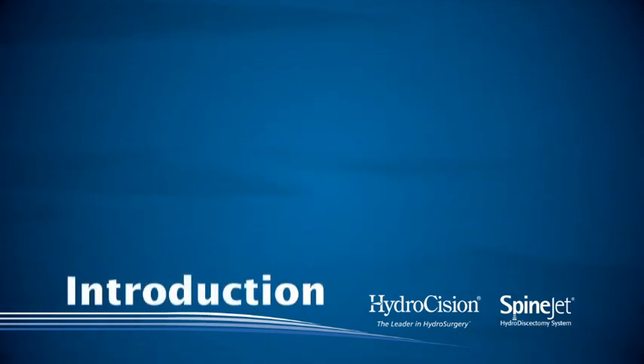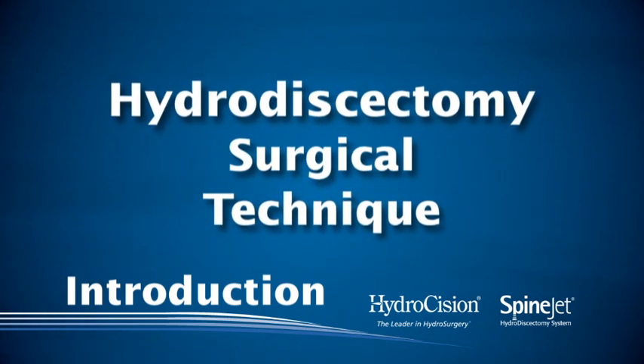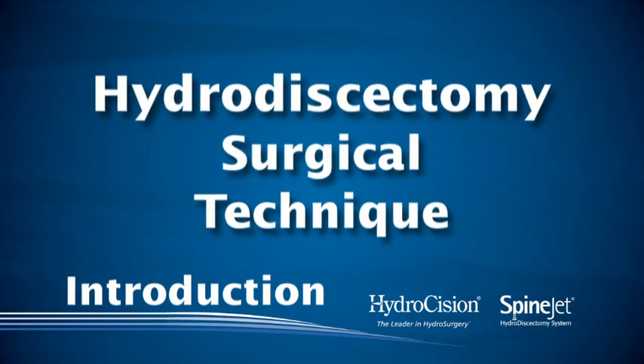This video will demonstrate the Hydrodiscectomy Surgical Technique, a minimally invasive surgery for the treatment of lumbar disc herniations.